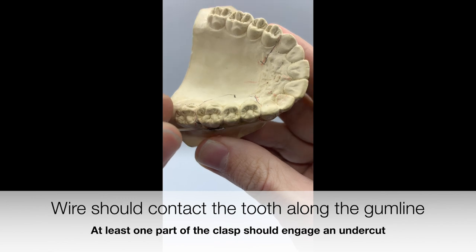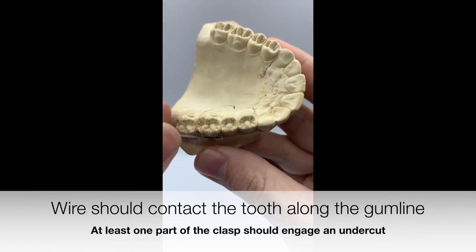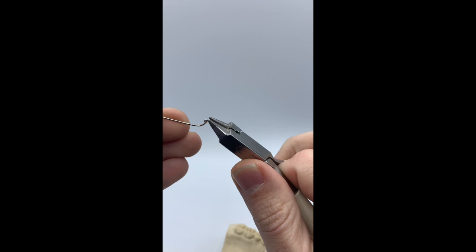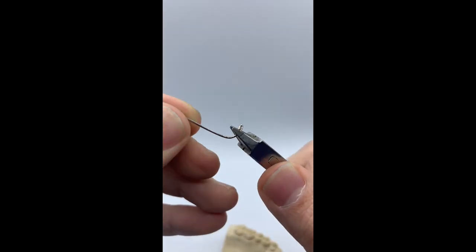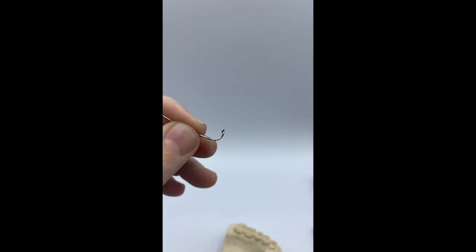You want to make sure the wire touches the tooth throughout the entire buccal surface. If you need to adjust, you can use your 139 plier or also the 3 prong plier to get that better arch.